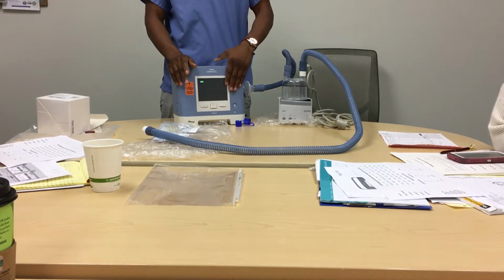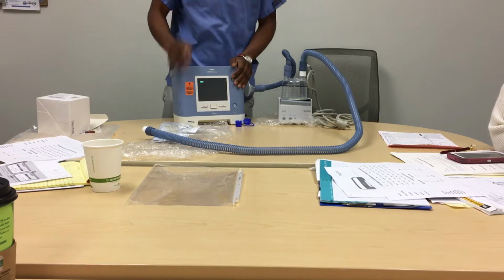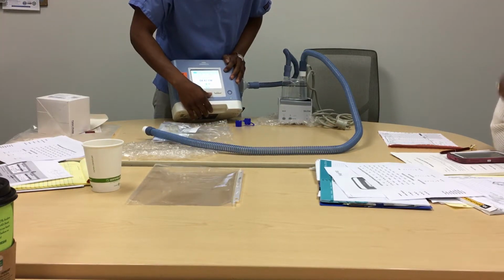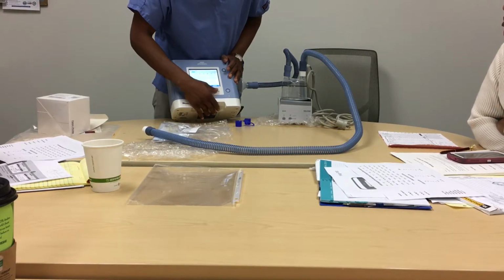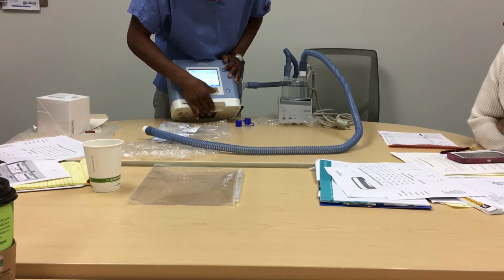Okay. So are the rise times and the flow rates set by you? The cycle sensitivities, yeah. That's good. So in fact, let's just go into it one more time and check the alarm settings now.